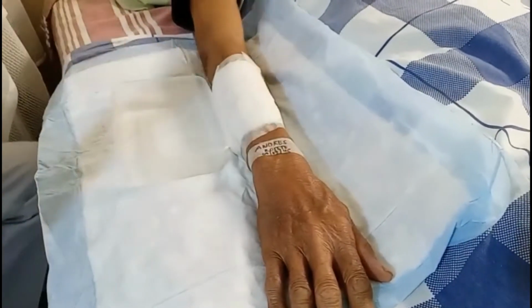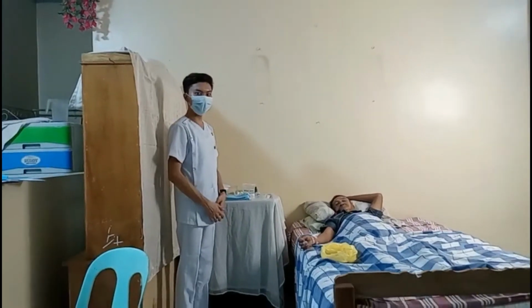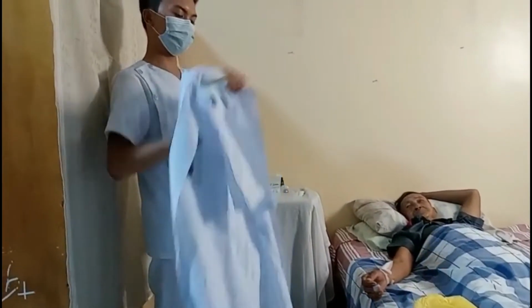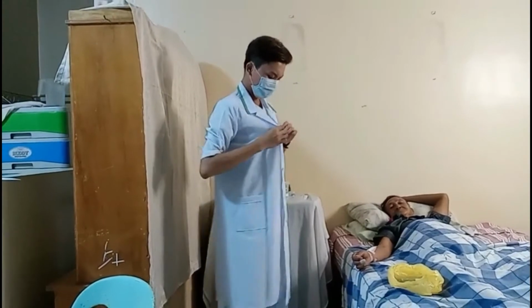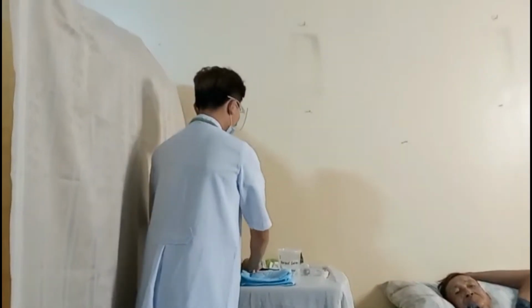Number 3, apply PPE, use standard precautions if needed, discard all dressings and gloves, and perform hand hygiene. This is done to deter the spread of microorganisms and also to protect the healthcare provider from acquiring any diseases or infections. Wear the necessary PPEs, the lab gown, face shield, and the gloves.